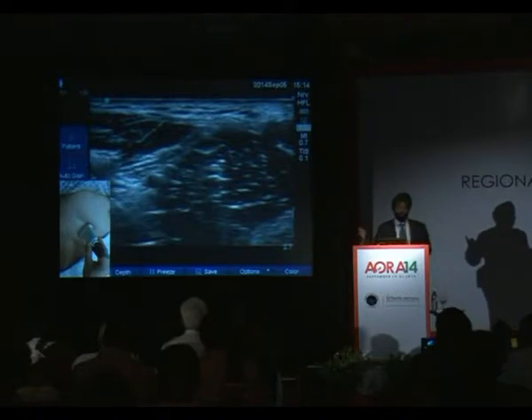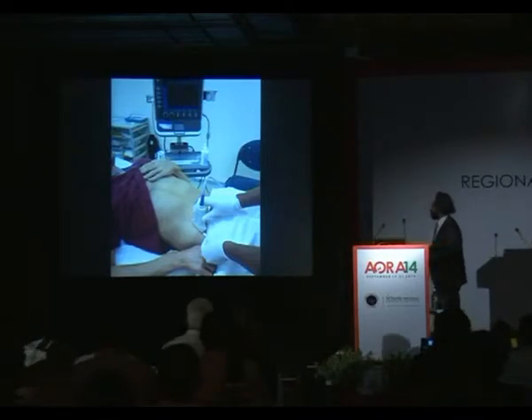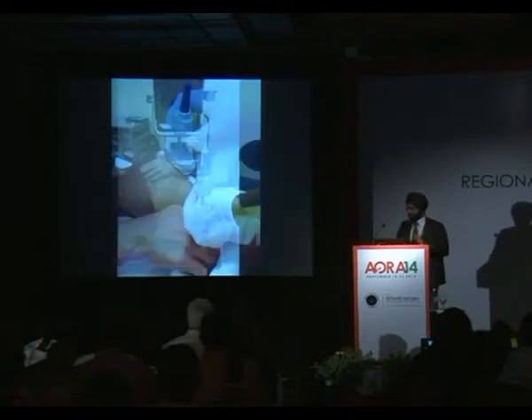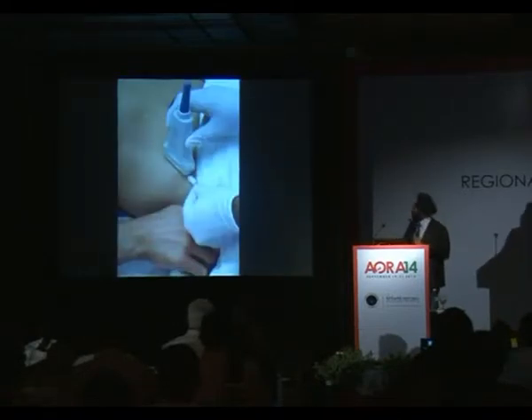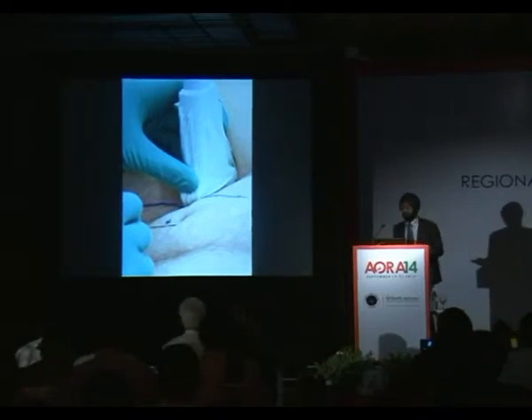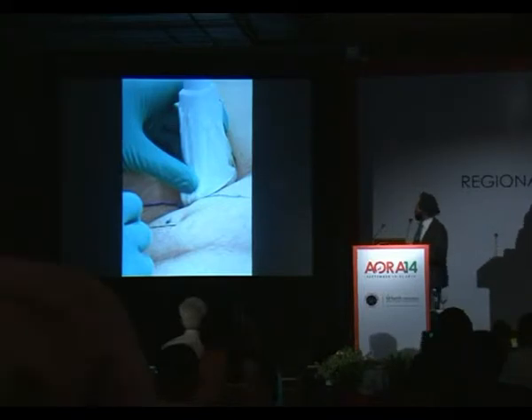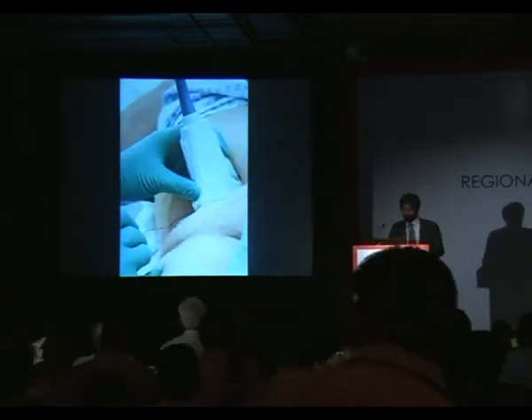Once we have this pattern in front of us, the rest of the work is quite easy. The needle is inserted in plane under the probe, with the probe being in the same direction. We have a lot of patients with big bellies, so if your assistant just retracts the anterior abdominal wall towards the other side, it will make your needling as well as the positioning of the probe much easier.